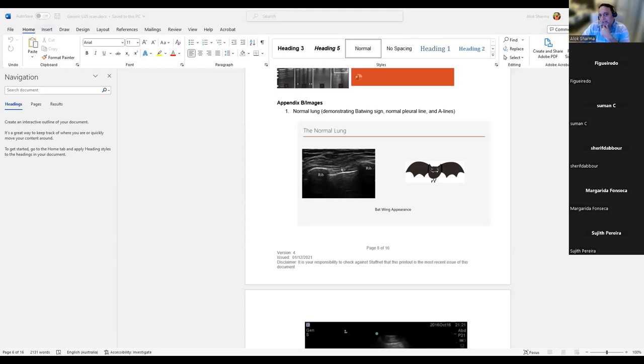But more importantly, the reason I discussed the last case with you is that if you have a standardized approach to how you're going to approach a pathology when you see it, in terms of waiting for a chest x-ray if time permits versus treating, incorporated in your guideline, which is what we've done in this guideline, then it allows a phase of transition while you're learning. More importantly, it provides a very robust framework for those people who don't know how to do lung ultrasound to treat that condition with uniform practice. And that just means that it's more accepted.